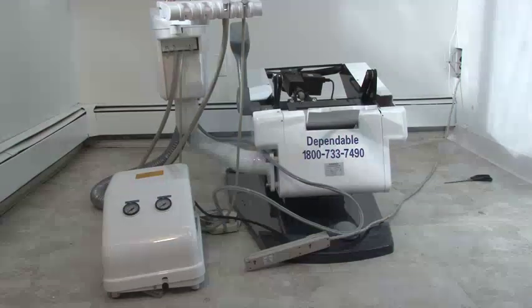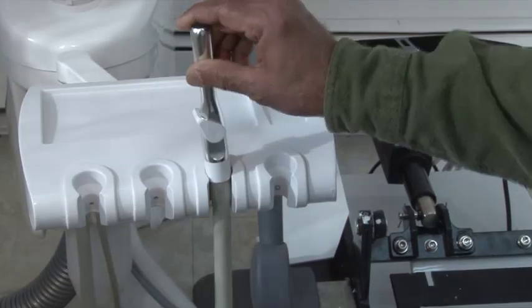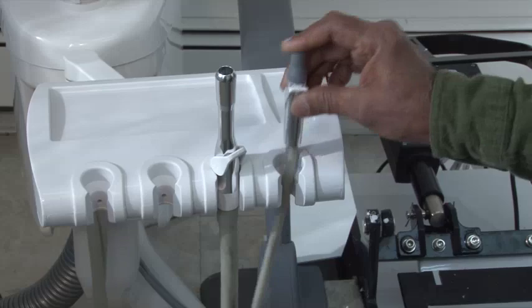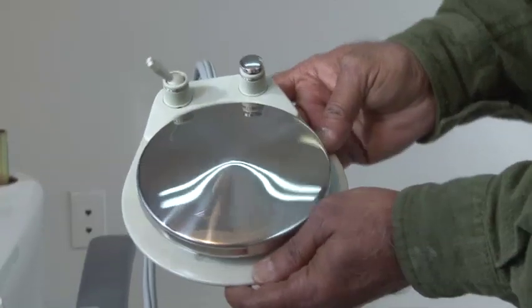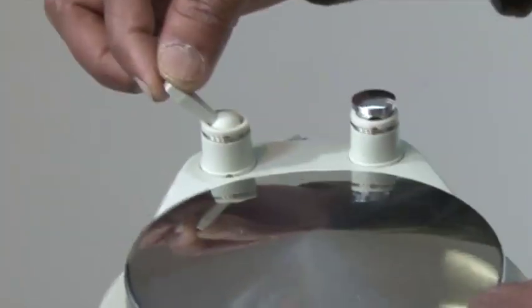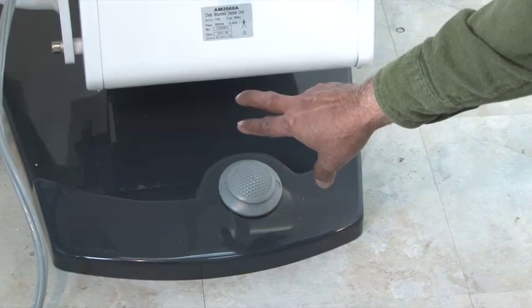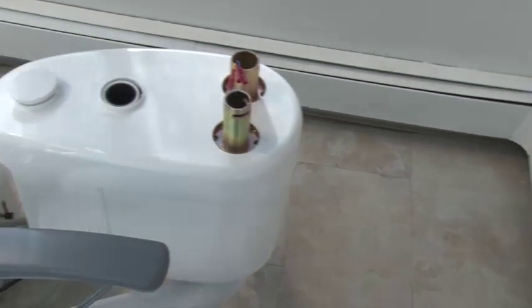Now let's identify the components of the chair: the assistant's tray, the high-speed and low-speed suction tubes, the foot control, the water on/off switch for the handpiece and the chip air button, the joystick or chair position controller, the light pole holder, and the delivery tray holder.